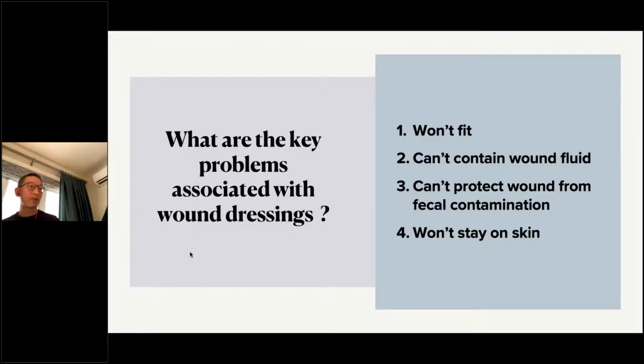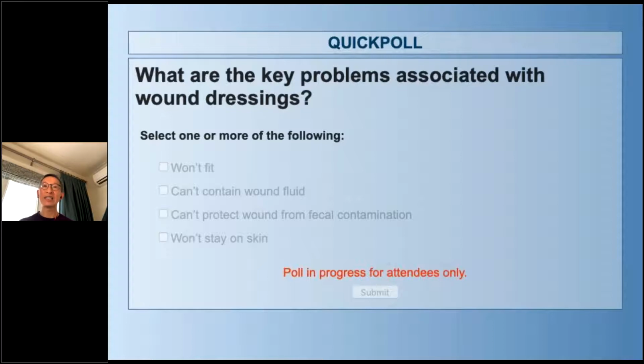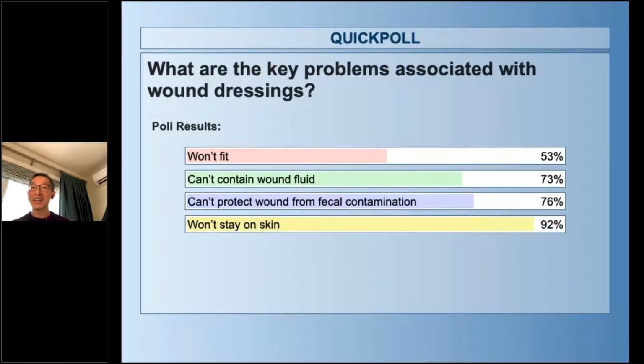All right, what are the key problems associated with wound dressings? I kind of mentioned a few of my concerns. Let's see your responses based on the few choices available to you here. The dressing won't fit. It can't contain wound fluid. It can't control or protect the wound from fecal contamination, or it won't stay on the skin, period. This could be interesting. Couple seconds. And here we are. Okay.